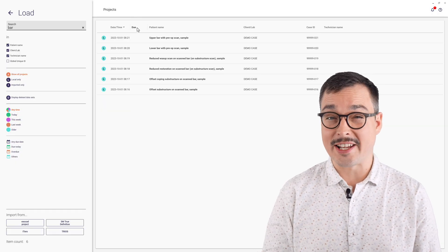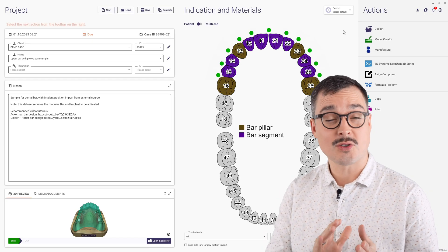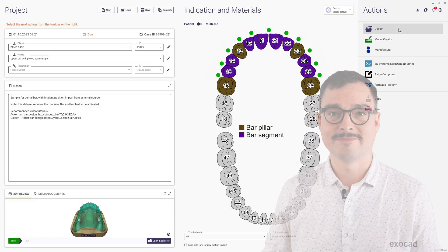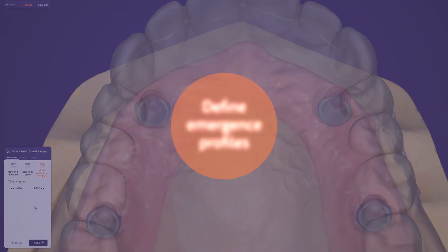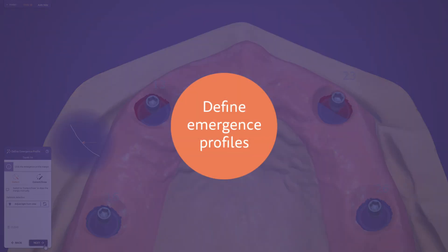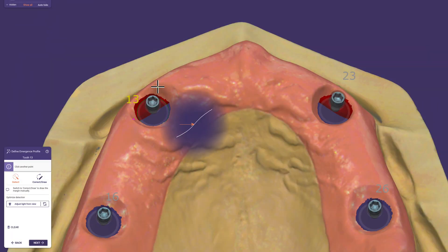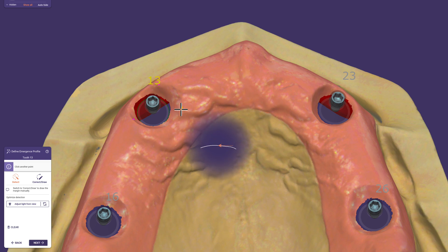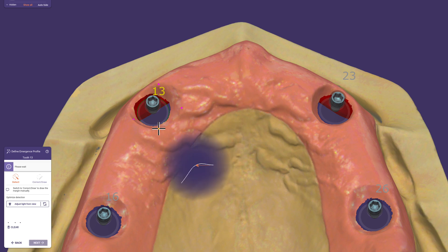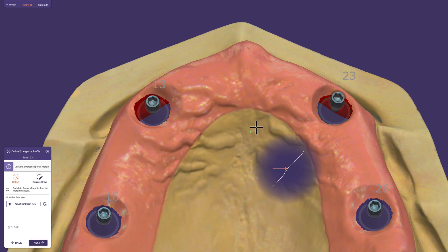Let's open the upper bar demo sample and start the case right away. We skip the prior placement and define the emergence profile margin only on both canine teeth to show the difference this causes later in this tutorial.